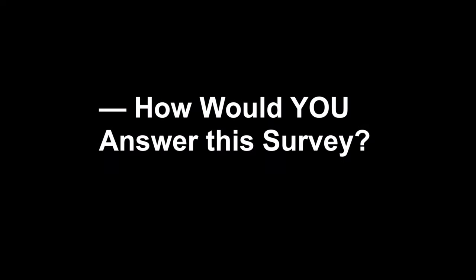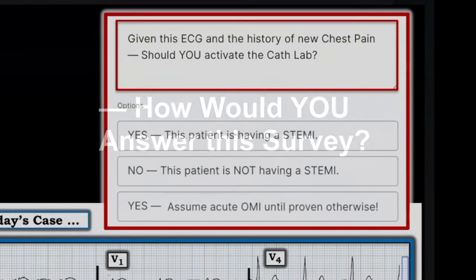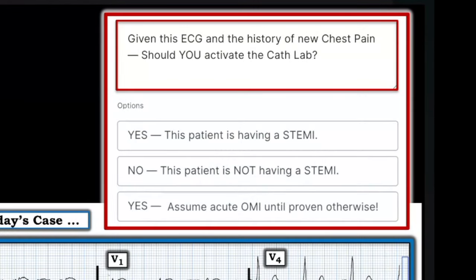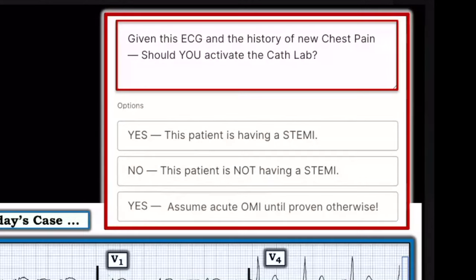The question is what would you do with this? Yes, this patient is having a STEMI — ST elevation myocardial infarction. No, this patient is not having a STEMI, so I would not activate the cath lab. Or yes, assume OMI until proven otherwise.